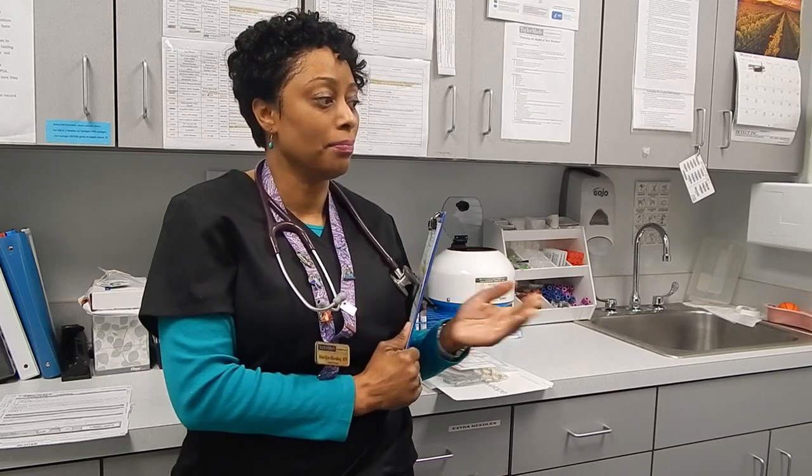This morning I have Ms. Crystal here and I'm going to be doing a sample from her. Good morning, Ms. Woods. My name is Marilyn. I see that you're here for a drug collection today — we're actually going to be doing a hair collection. I need to see your picture ID.